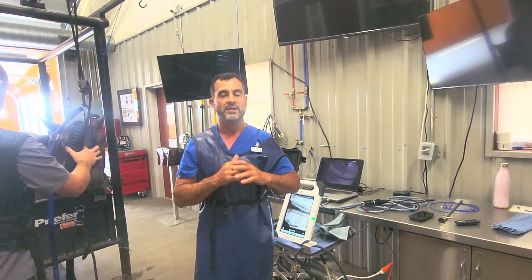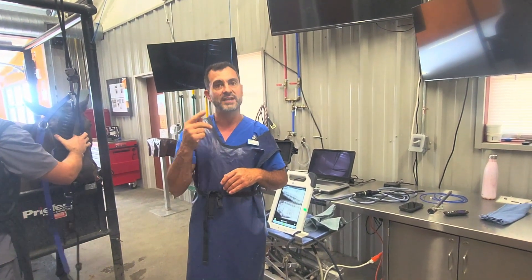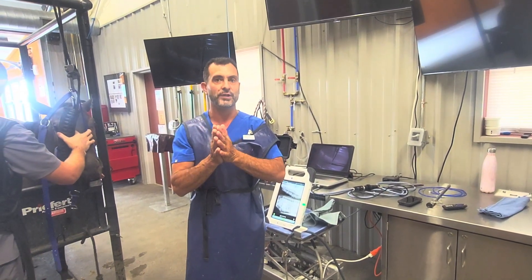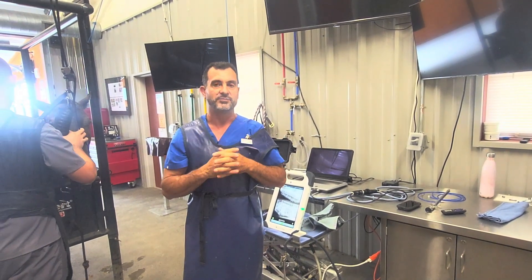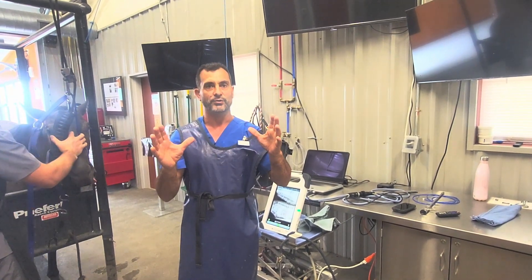Keep in mind the most important thing is always the oral exam and the history, then combining those with your radiographic findings. Never rely only on radiographic findings unless it's something very obvious — you want to take in the whole picture always.